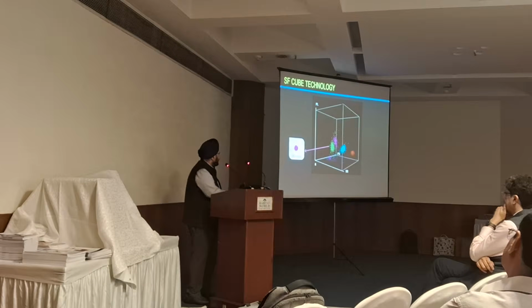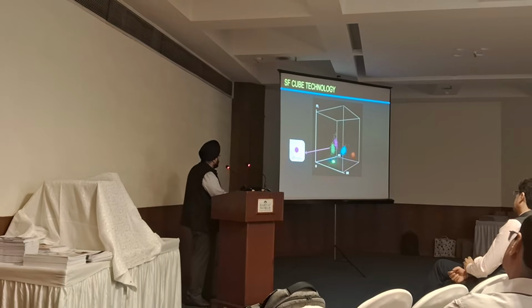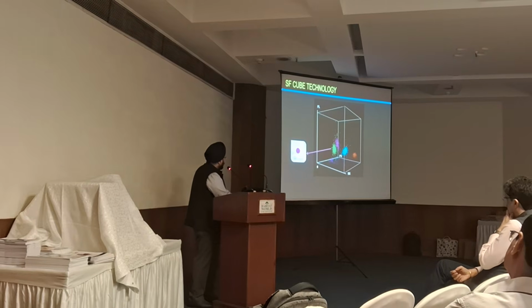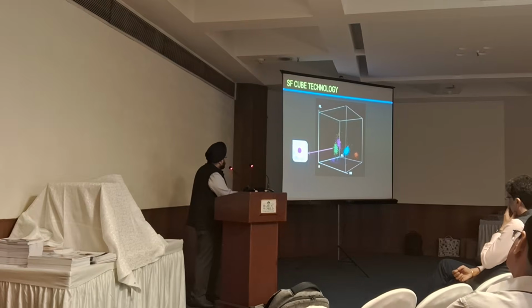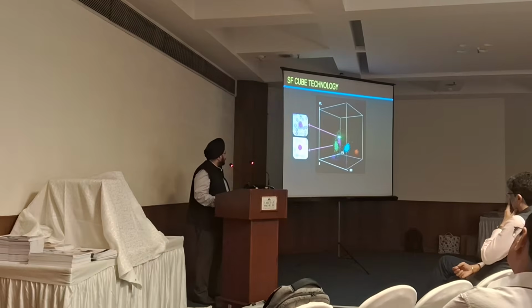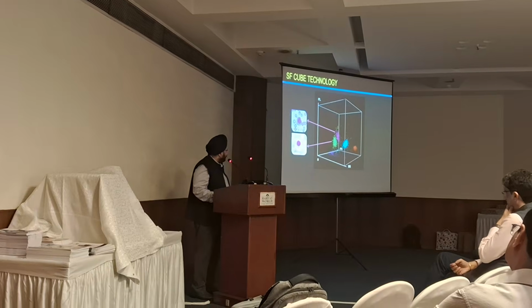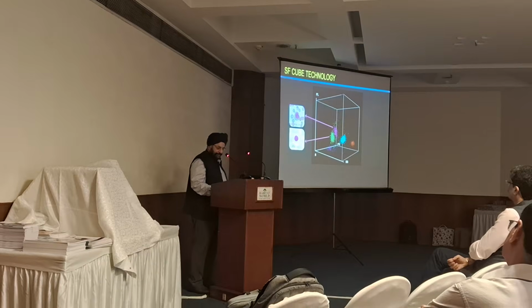You look at these green dots here, these are basically nothing but your lymphocytes. You can see that they are on the extreme left of the side scatter, which means that they have the least granularity. And on the forward scatter, they are placed a little bit in the mid segment, with this pink cell line just ahead of it. So this pink cell line is the monocyte. Obviously monocytes are bigger than lymphocytes, hence ahead of the green area. But both of them have very little granularity, so they are on the left side of the side scatter.